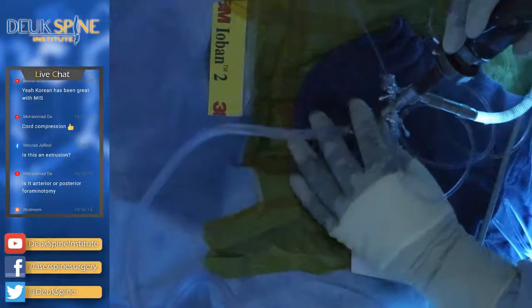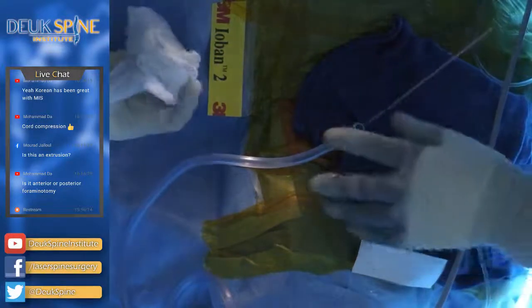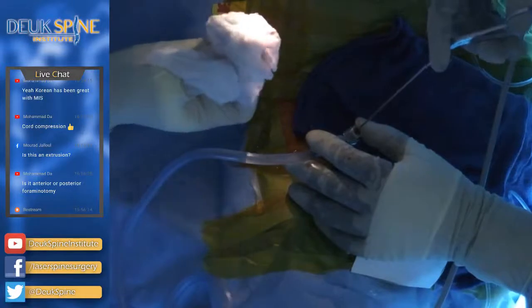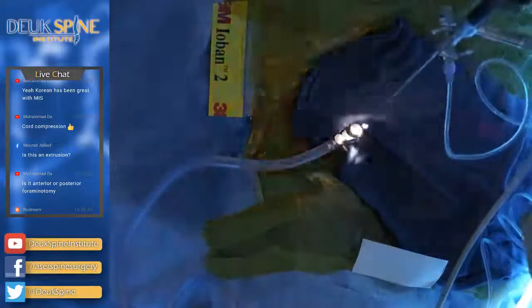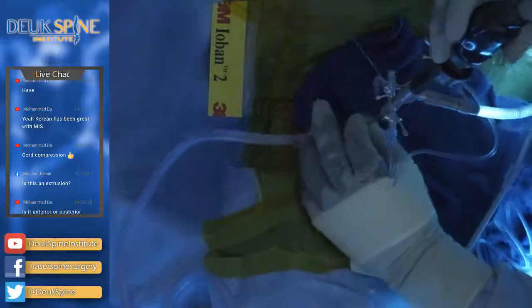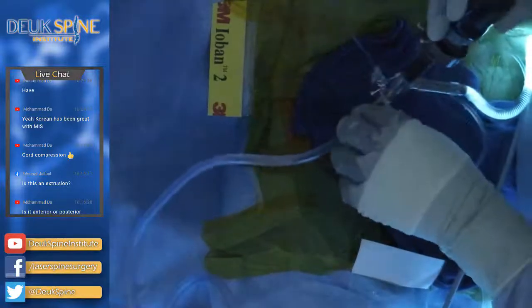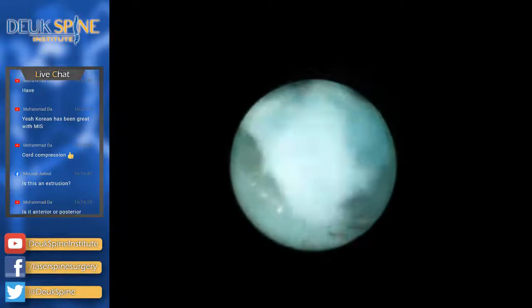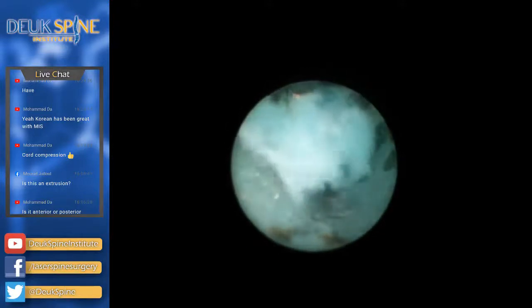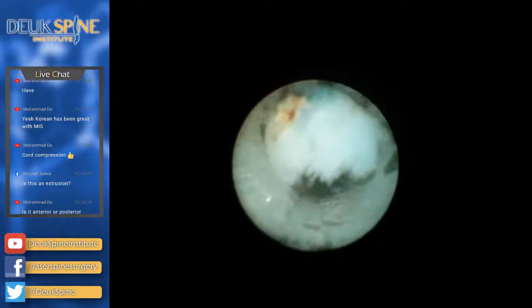There's a piece of herniation moving around. Let me grab that. They also use a different laser than I use when they use a laser. So just different techniques. They don't do the annular debridement that I do, since that's our discovery here at Deuk Spine. All right. Let's see what we got here. There we go. That is a piece of herniation right there that is huge. I'm trying to release it with the laser, and then I'm going to grab it with the pituitary. It's pretty big. I don't know if I can get around it.